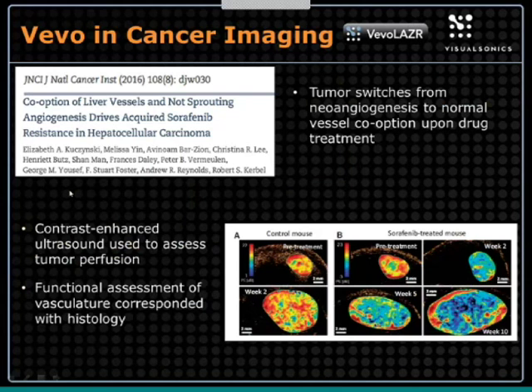And I do want to point out, of course, that contrast-enhanced ultrasound was used to assess the perfusion. Okay, so contrast-enhanced, we have these small microbubbles. We inject them in, and we get a very strong ultrasound signal from these microbubbles, and we can assess the perfusion because the microbubbles stay within the vasculature. They don't leak out, as opposed to the nanoparticles. The microbubbles are much bigger.